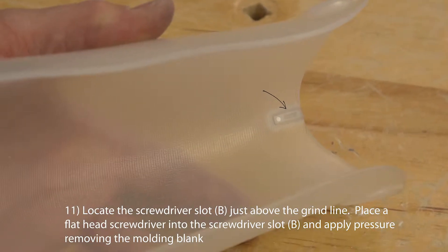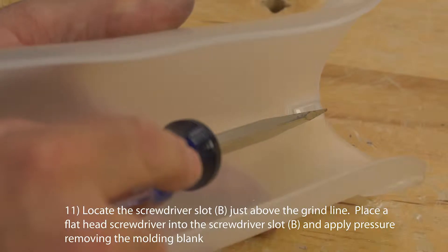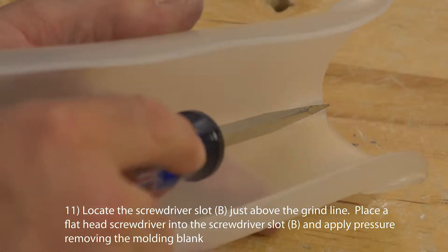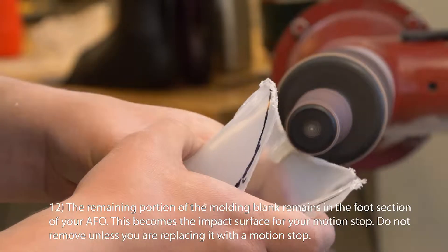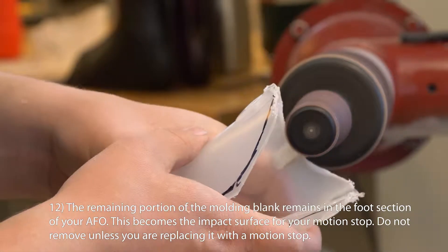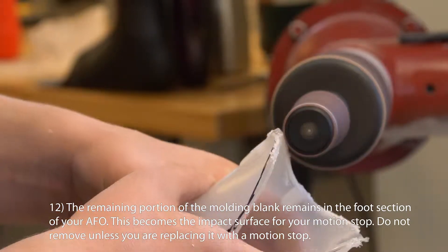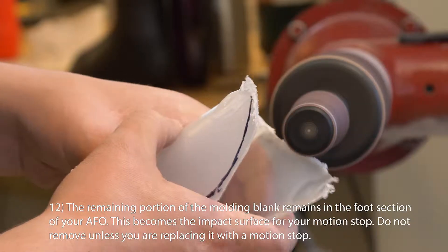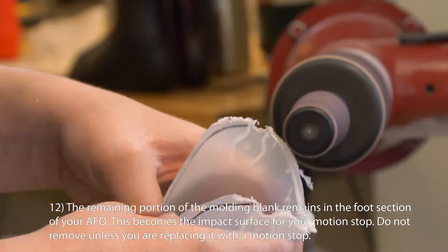Locate the screwdriver slot B, just above the grind line. Place a flat head screwdriver into the screwdriver slot and apply pressure, removing the molding blank. The remaining portion of the molding blank remains in the foot section of your AFO. This becomes the impact surface for your motion stop. Do not remove unless you are replacing it with a motion stop.